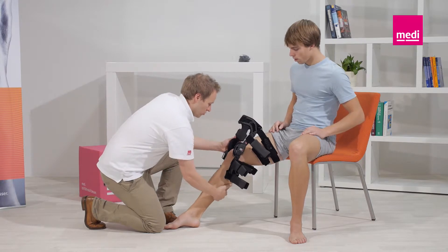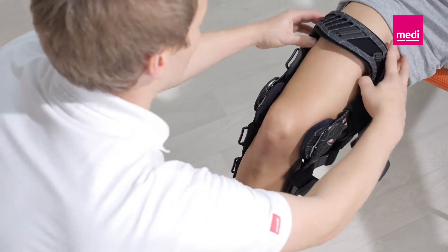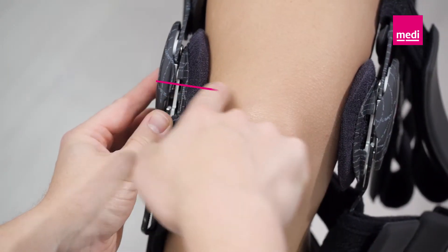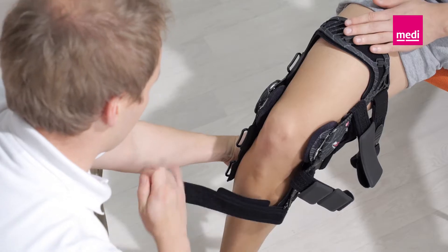Pull the orthosis over the leg and bend the knee to 45 degrees. Position the orthosis so that the middles of the hinges are at the level of the superior border of the kneecap. Make sure that the orthosis is not twisted on the leg.